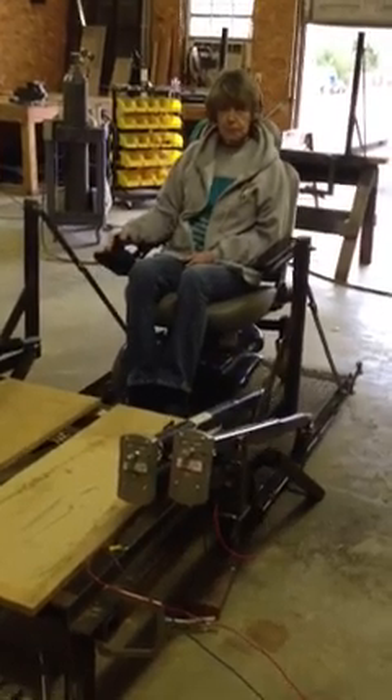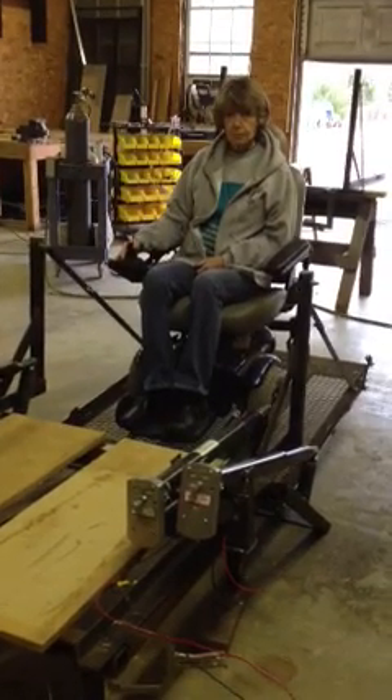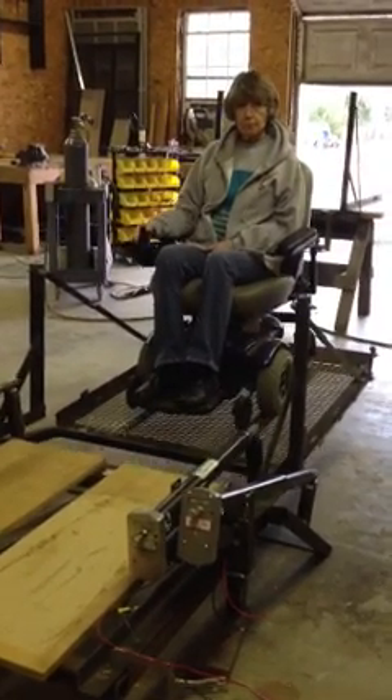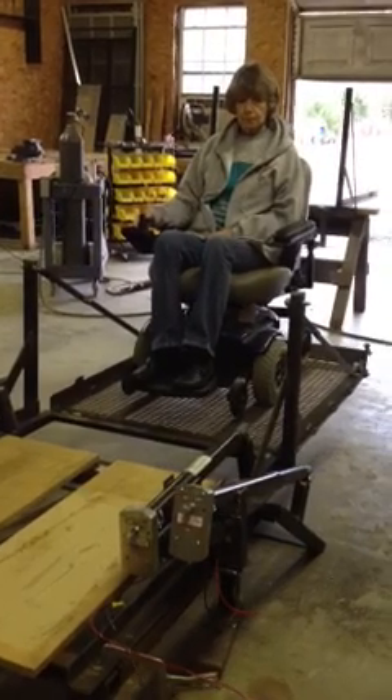We don't have our safeties and our switches and all that wired up yet — we're just doing this straight off the battery. But there will be safety stops for up and down positions. Okay, that's completely up.